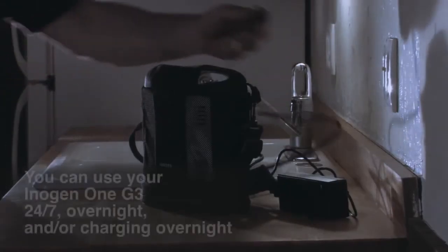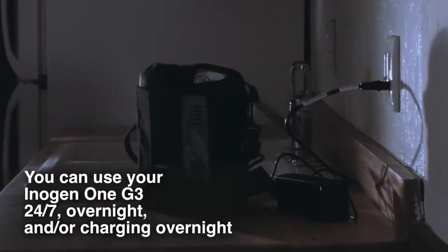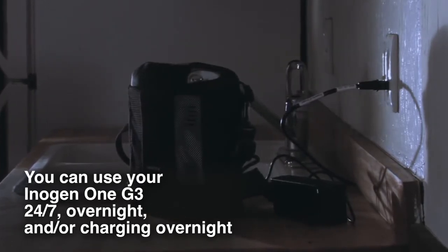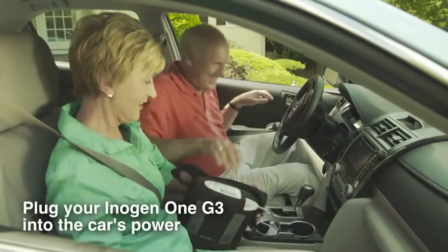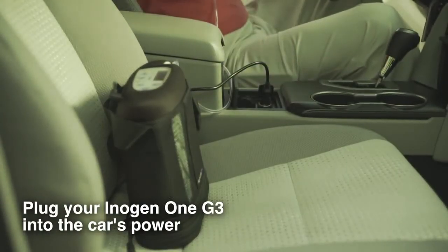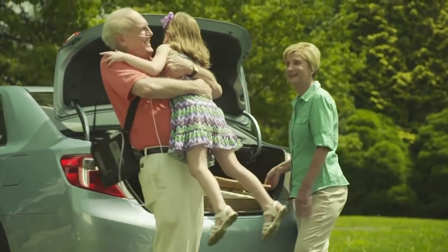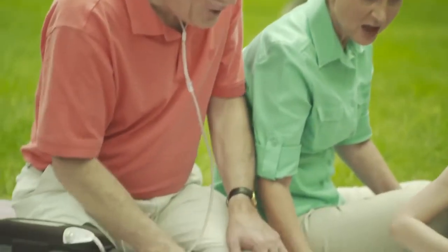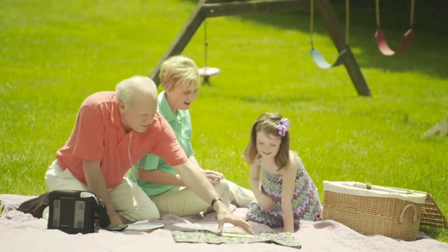For example, you can leave the Inogen One G3 plugged in all night with a battery attached, and when you wake up, you can use the Inogen One on battery power alone around the house. If you get in the car to run an errand, you can plug into the car's power by using the G3 DC power cable provided with your system, and then unplug from your car's power when you get to your destination and run on battery power alone again. If you'll be gone for the entire day or overnight, you'll want to bring extra batteries and your AC power supply.